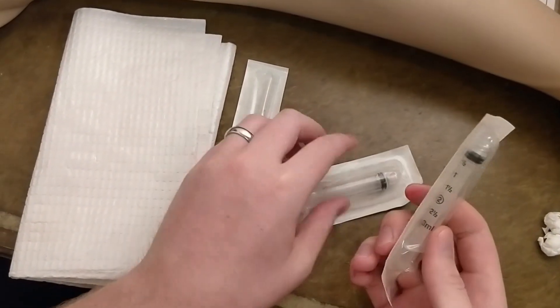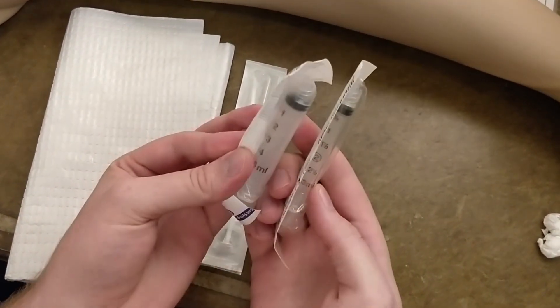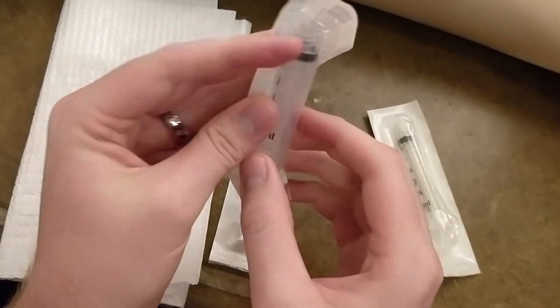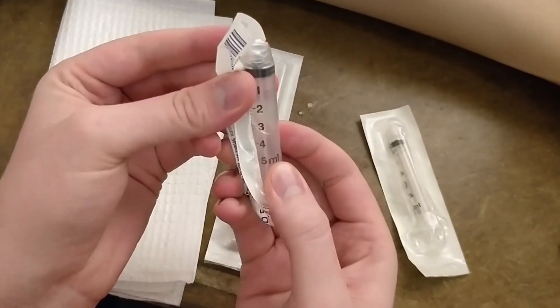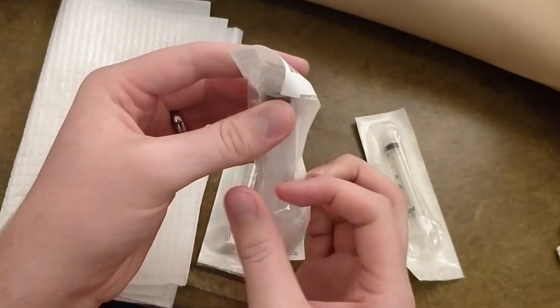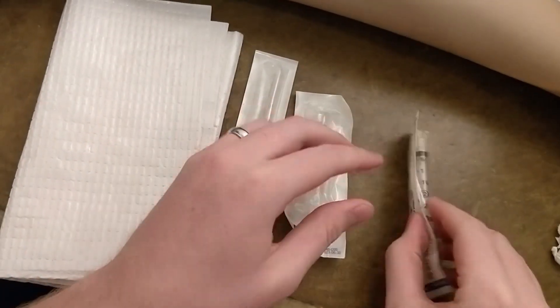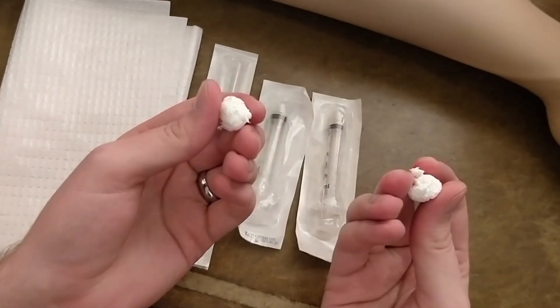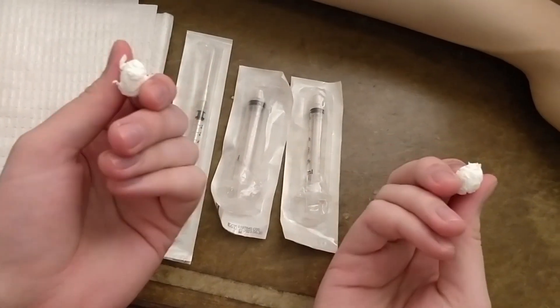For the sodium fluorescein injection, in the video we do use a 3ml syringe. We only were able to find a few of the 5ml syringes — this is the one that you will want to use on boards, but for the sake of the video we only used the 3ml because there were more of them. Lastly, we ran out of cotton balls, so rolled up tissues — that's what we got.